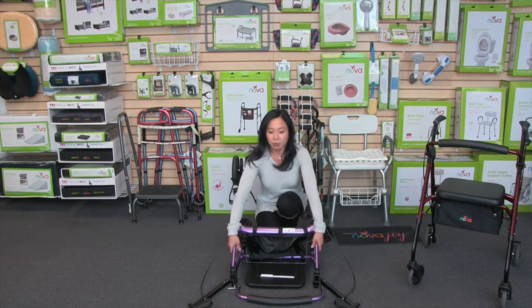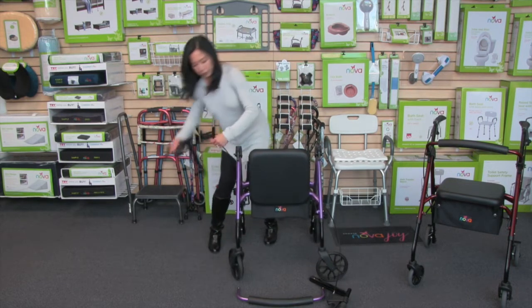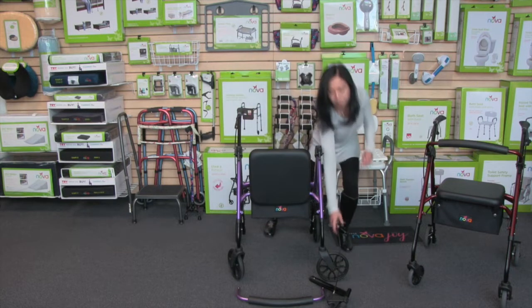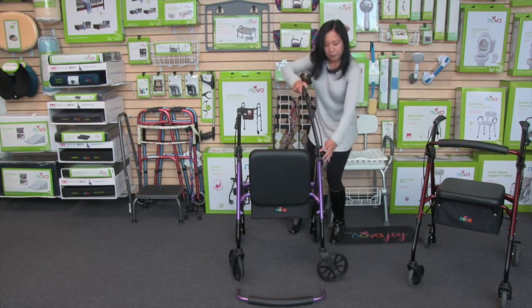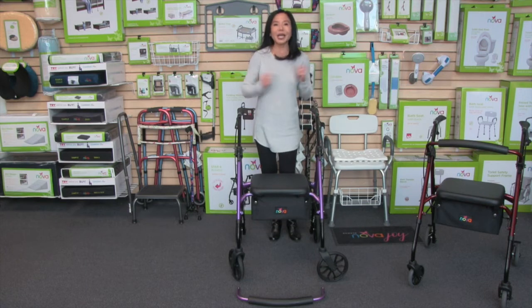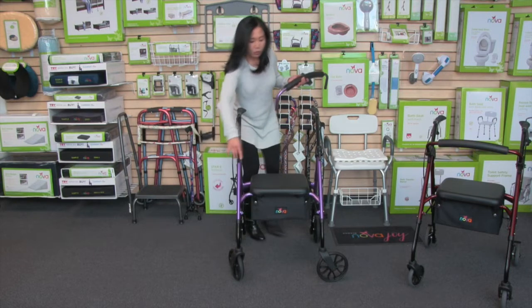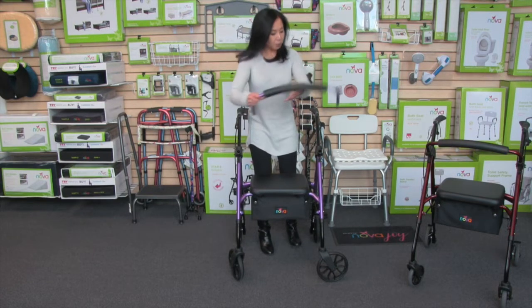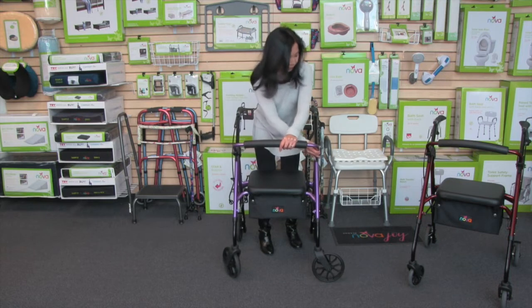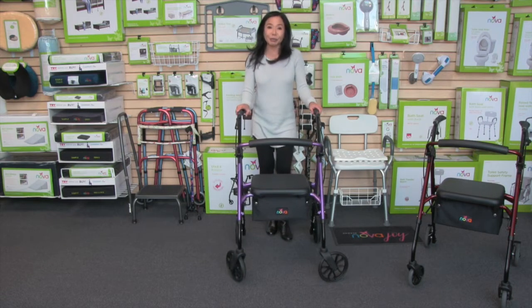All right, now go ahead and stand up the walker. And now I just insert the handles. Same thing, push the button. And then the last part is just installing the backrest. You're going to push down the inserts, make sure the buttons are facing upward, insert the backrest, give those push buttons a little push, and it just snaps into place. There you go. That is the quick and easy assembly of the Star.